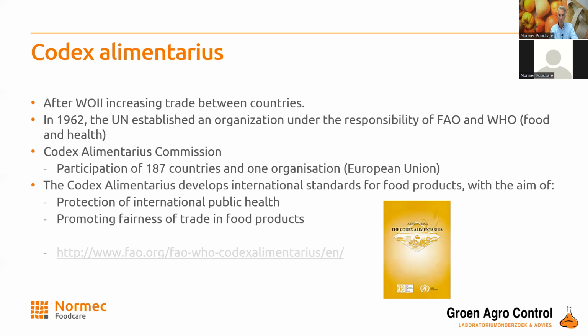Most of the residue tests from the Codex Alimentarius are really common. A lot of different methods are included, and that means that if a client asks for this kind of residue analysis, it's big money. Say even about €1,000 you have to pay for all these tests.